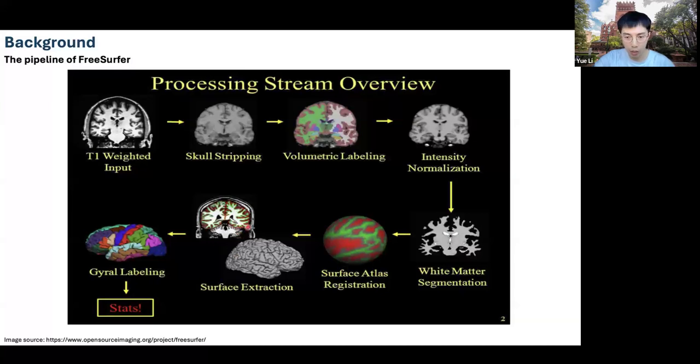This pial surface will stop at the gray matter and CSF boundary. This step keeps the topology unchanged and keeps the correspondence between the mesh and atlas, so that this correspondence can be used in the next step, which is the parcellation. With this correspondence, we can directly map the labels on the atlas to the surface to finish the cortex parcellation, like this color map shows.